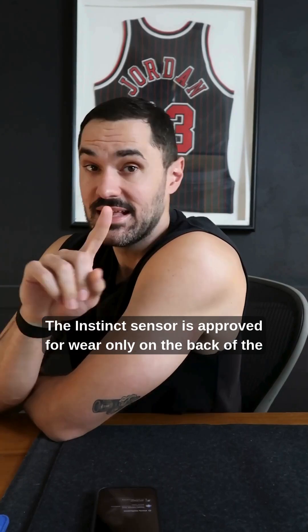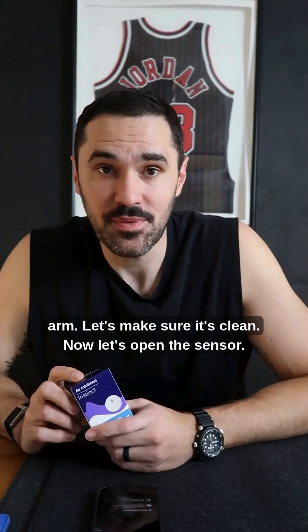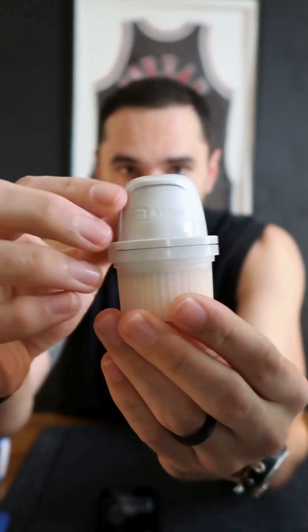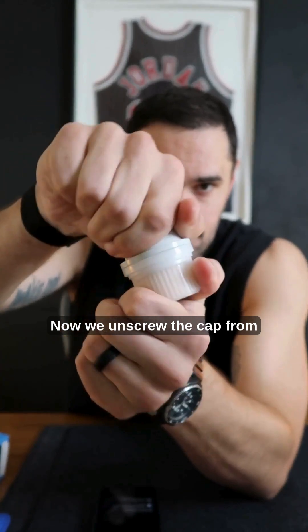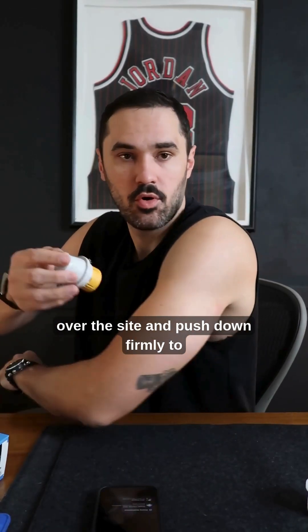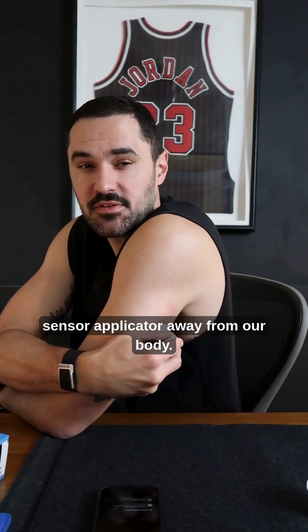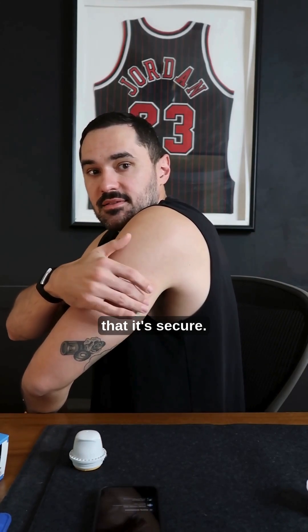We're going to use the back of my left arm. The instinct sensor is approved for wear only on the back of the arm. Let's make sure it's clean. Now let's open the sensor. Now we unscrew the cap from the sensor applicator. We're going to place the sensor applicator over the site and push down firmly to apply the sensor. Now we're going to gently pull the sensor applicator away from our body, and we're just going to make sure that it's secure.